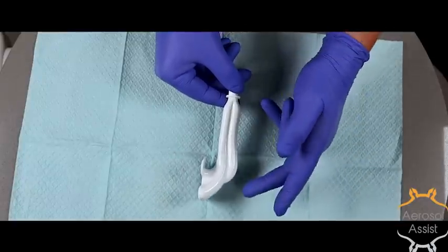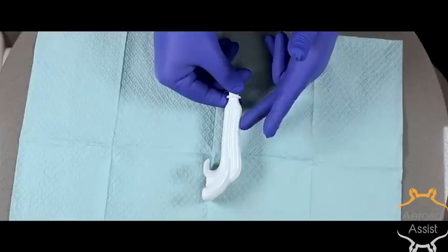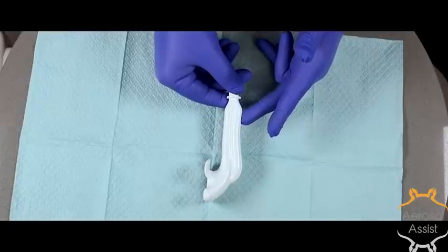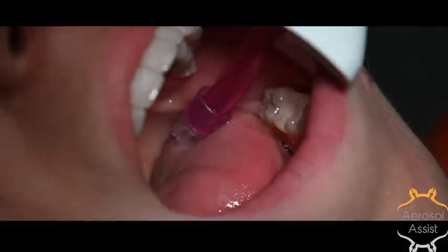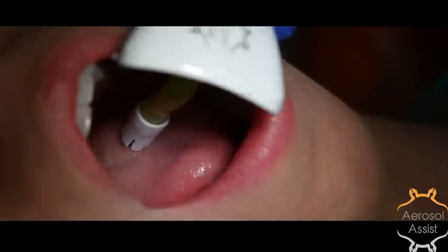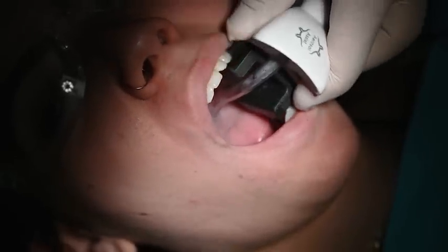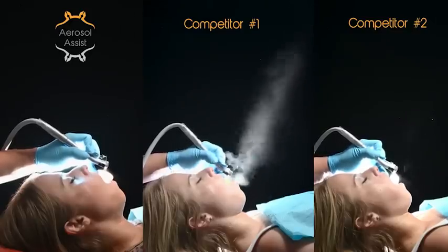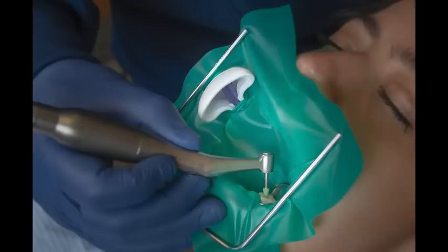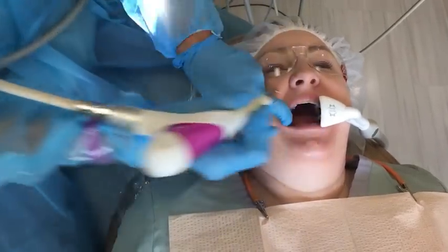The aerosol assist is a very simple device comprising two channels. One is dedicated to removing intraoral fluids. The other is a 35 mm aerosol port at the top dedicated to removing aerosols and splatter during procedures. It is a hands-free device hanging onto the patient's lips via the curved buckle plate. It can also be used in conjunction with a bite block. The aerosol assist is designed to complement other infection control techniques and systems and works great with cheek retractors, rubber dams, bite blocks, ultrasonic scalers, high speeds, intraoral cameras, intraoral scanners, and lasers.